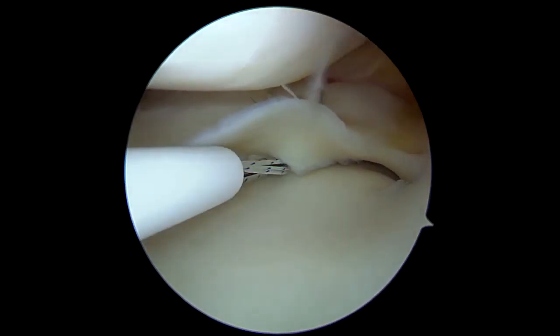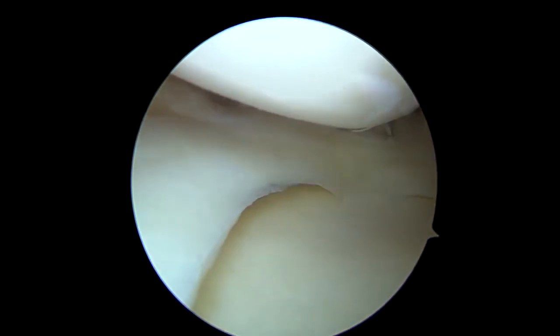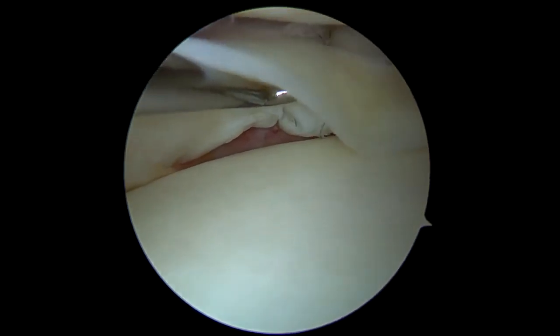In this case, additional suture for the longitudinal meniscal tear is also done with the FASFIX suture device. The repaired lesion is examined again and confirmed to be stable with proper tension.